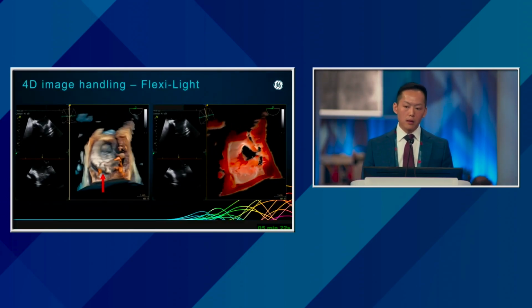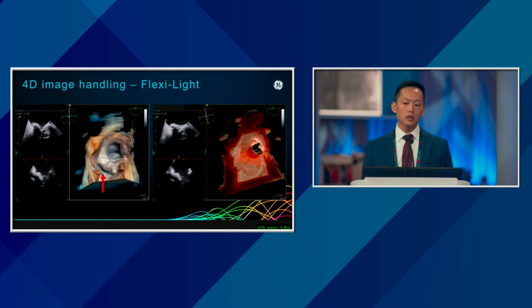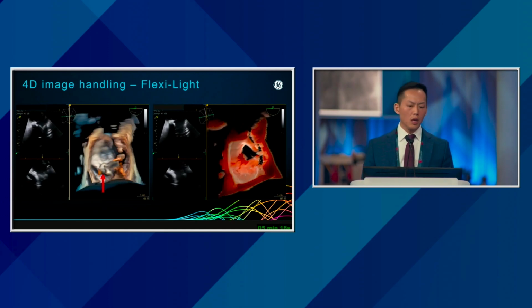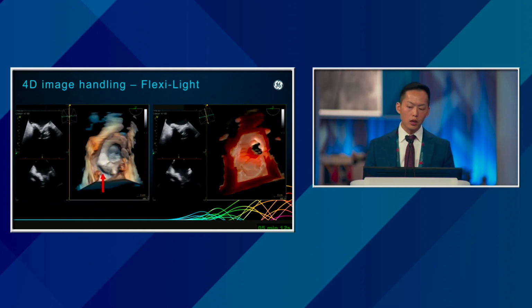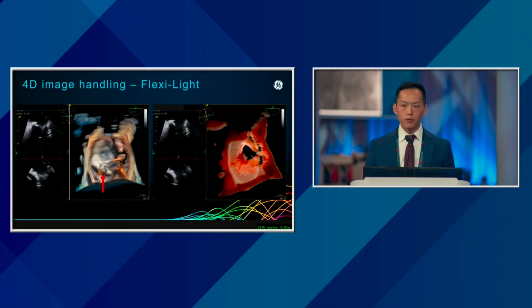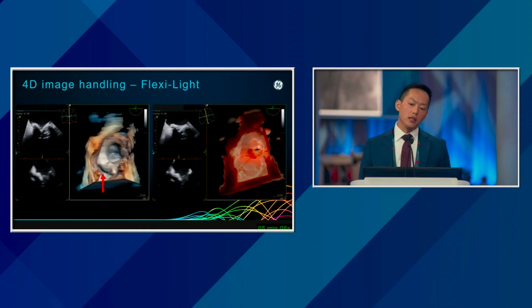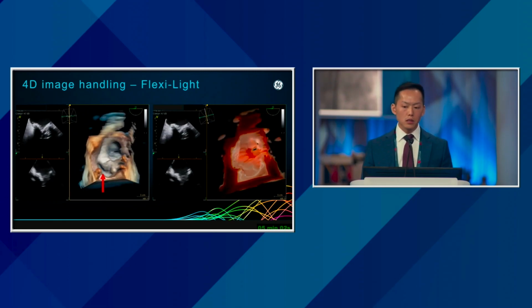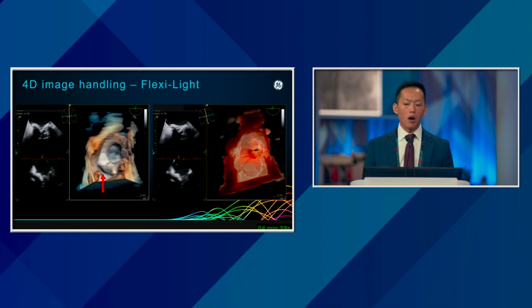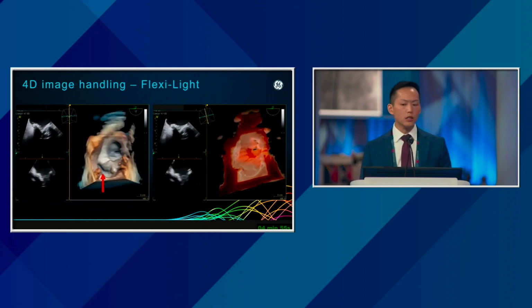And then image rendering. Image rendering can be very, very useful again in terms of evaluating tricuspid for different details around the leaflets, or in this example here, this is a bioprosthetic tricuspid valve that we were trying to look at and treat. On the left side with conventional rendering, we saw that there is a little bit of a shadow there on one side of the sewing ring. And the question, of course, was, well, is that actually a defect or not?